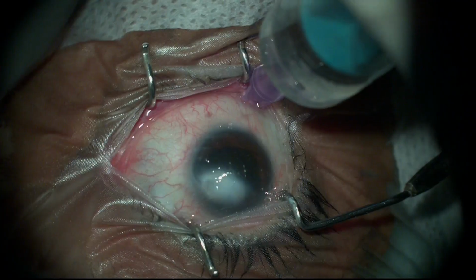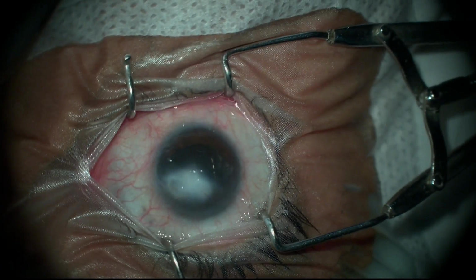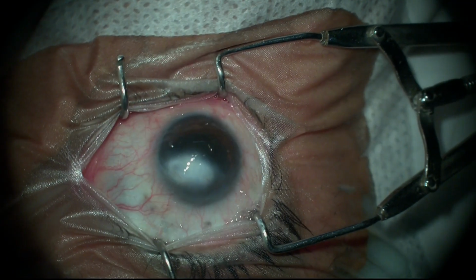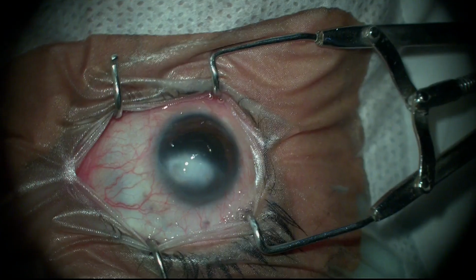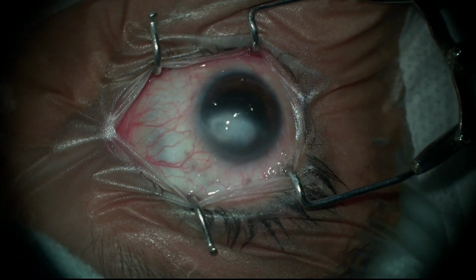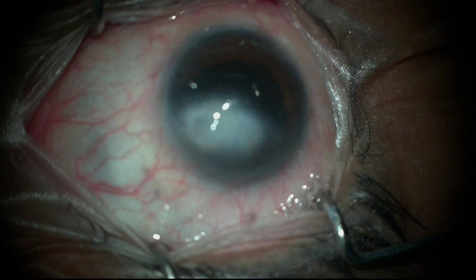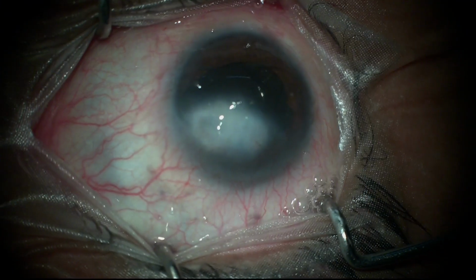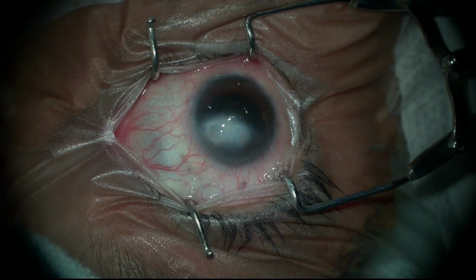I always wondered whether putting this injection fast or putting it slow would be more comfortable for the patient. But I think slow should be better. But will that not prolong the... So it will give time for that symptoms.